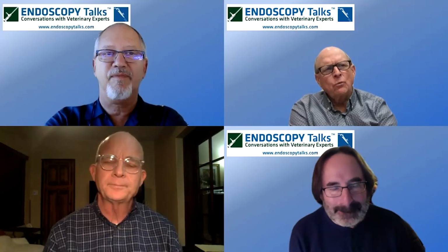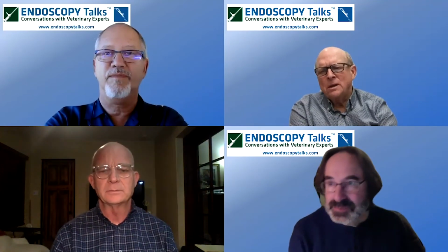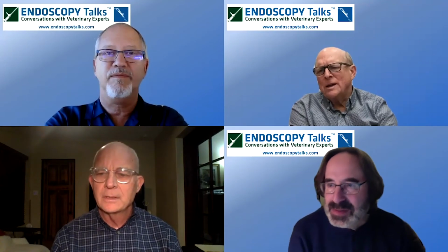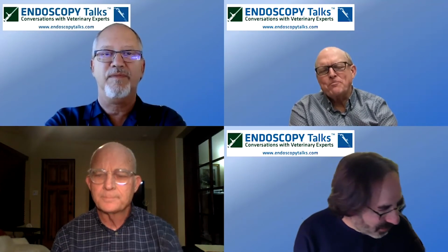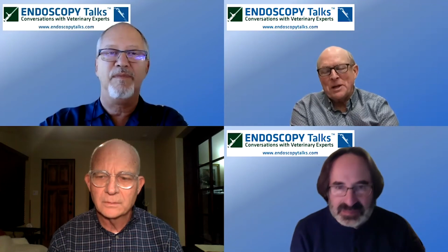No, not really. I think those are all good ideas. I think as a general rule, if I spend half an hour and I'm not getting any success at all, and I've utilized all my instruments, then at that point, if the patient's a good candidate for surgery, I will just take them to surgery. Sometimes you'll have less anesthesia time, and at my hospital, sometimes it's less expensive.